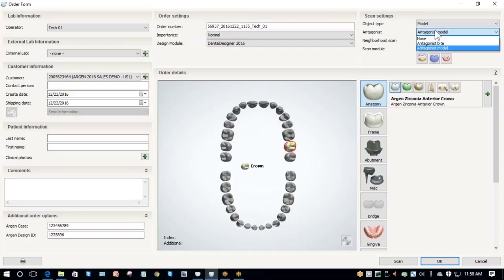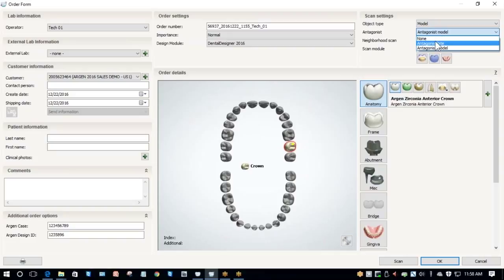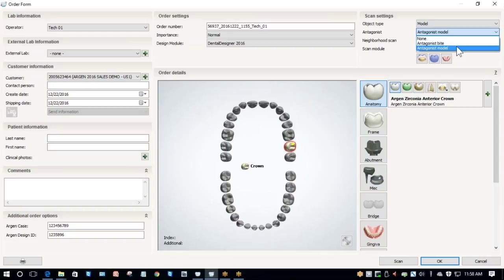Next, you need to select your Antagonist Type. You've got three options. None is the option if you either don't have an opposing model or don't have teeth opposing your crown. Antagonist Bite, if your model is too large to fit articulated inside your scanner, you can take a bite and scan that instead. Or Antagonist Model, which means you're scanning the poured model that's been articulated. For this case, we have a poured and articulated model, so that's what we're going to select.